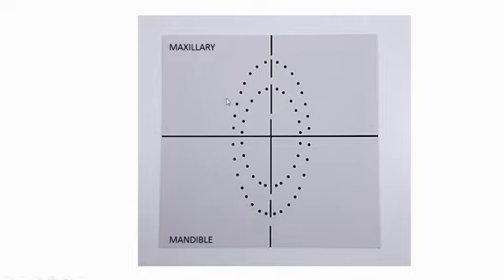For example, if you follow the system from the first quadrant 1 to 8 it is there. For the pedo patients it is also there 1 to 5. ठीक है. 6 भी दे रखा है. तो you can just keep the sheet on it, the rubber dam sheet, and mark on the tooth which you are planning to place the rubber dam. It can be a single tooth like upper 7 or multiple teeth.